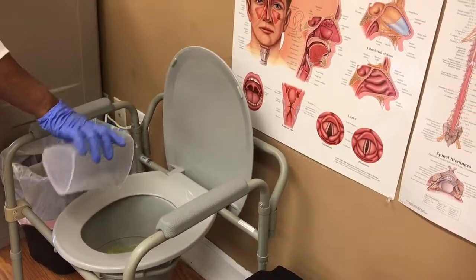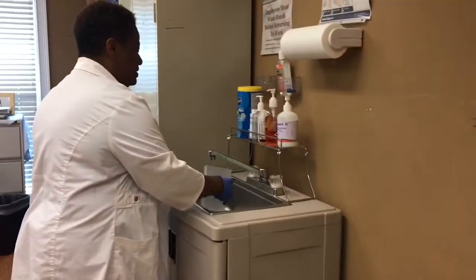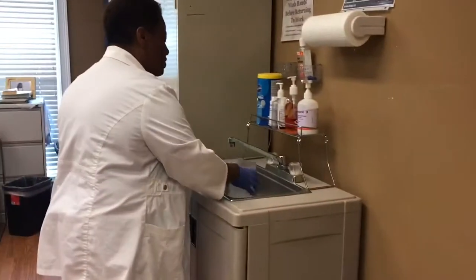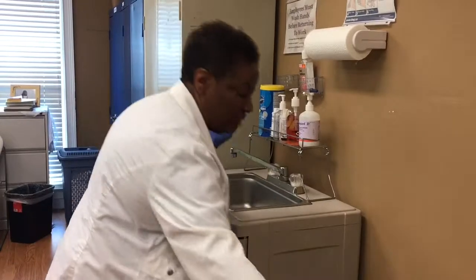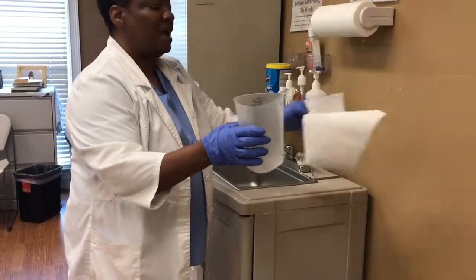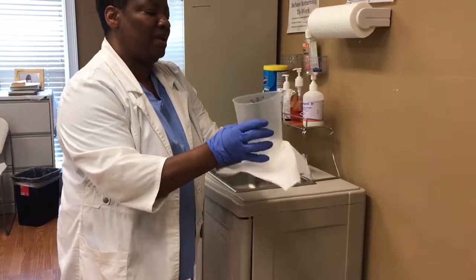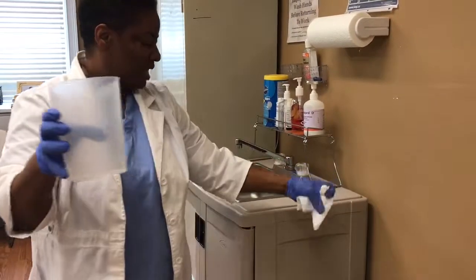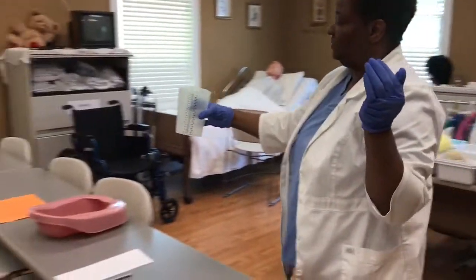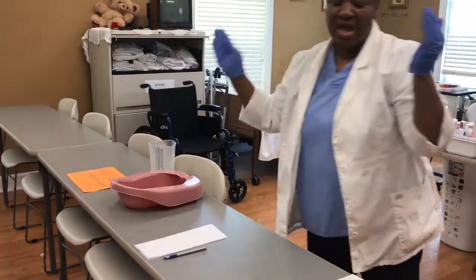I'm going to rinse the container and pour the contents into the commode, rinse the container and pour the contents into the commode again. Then I'm going to dry my container and place it in the designated area.